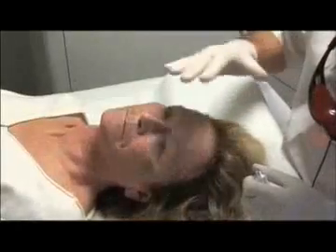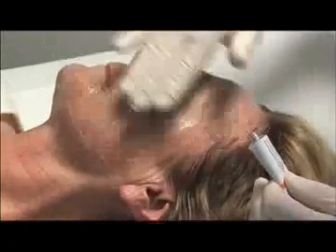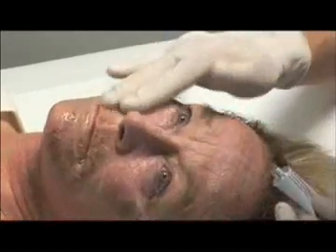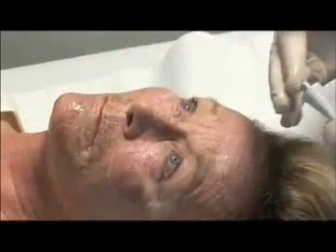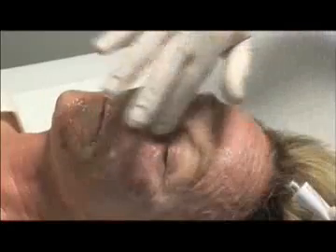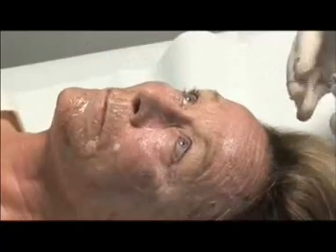The intervention is now finished. We have sprayed with thermal water, mineral water, which will stay in contact and on top of the skin. We will then apply an occlusive cream that is both antiseptic and oil-based in order to avoid incrustation. What we want to avoid is infection and incrustation. These are two major risk factors that will prevent healing.